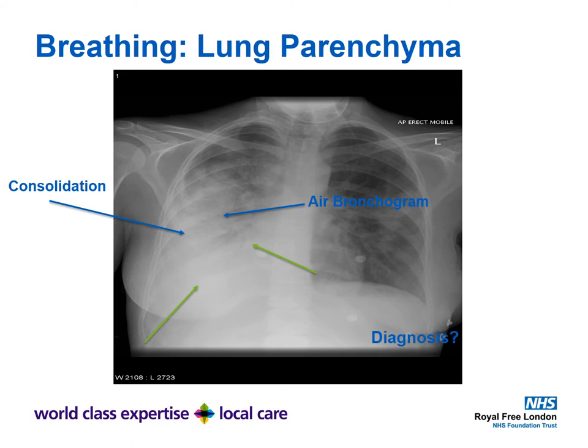Looking at the parenchyma — B for Breathing — you can see consolidated lung. The green arrows point to the rib above and where the diaphragm ordinarily would be. The consolidation looks like a radiological cloud. Tracking your eyes upward from the consolidation you'll see black patches between the clouds — these are air bronchograms, reflecting air passages between pus-filled alveolar sacs. This is a classical example of pneumonia.